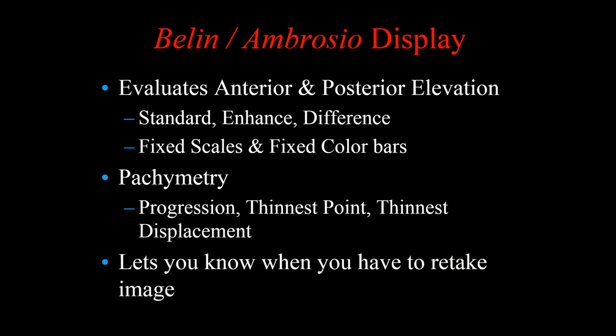So the Belin Ambrosio display, again, evaluates both the anterior and posterior elevation using both a standard and an enhanced reference surface. It gives you then what the difference is. One of the benefits of the display is that all the scales and colors are fixed. So once you get used to it, you should be able to do a really rapid screening in seconds. I can look at the map because I don't have to look at the numbers, because the colors and the scales are all fixed. And I can screen a patient very, very rapidly.